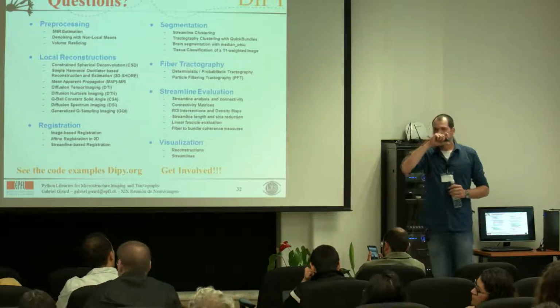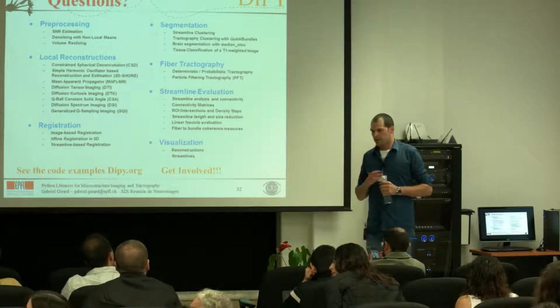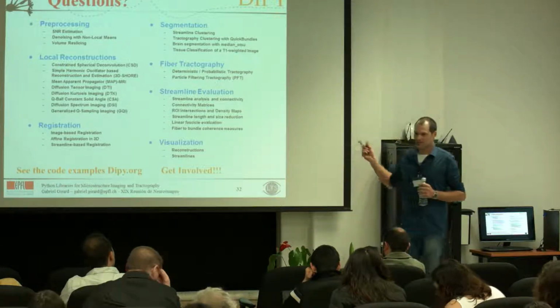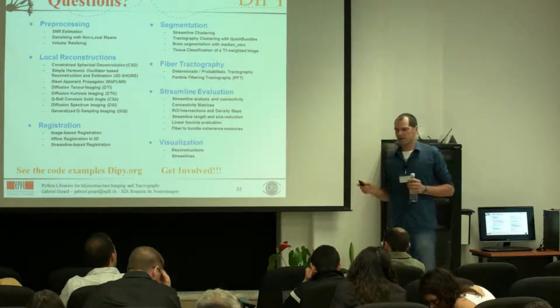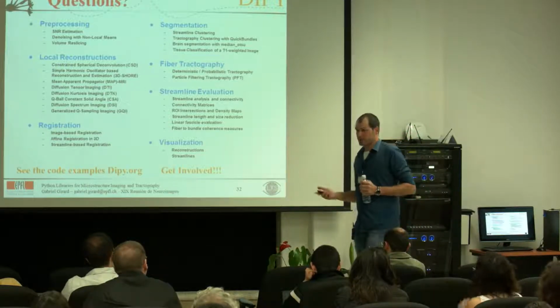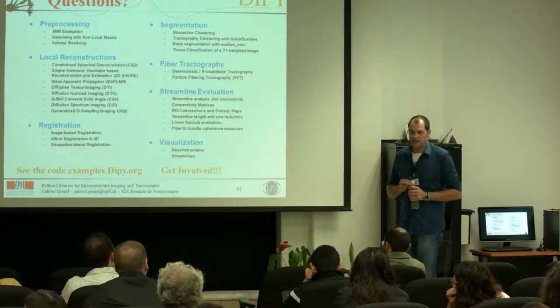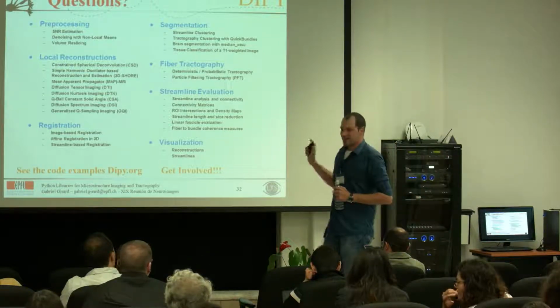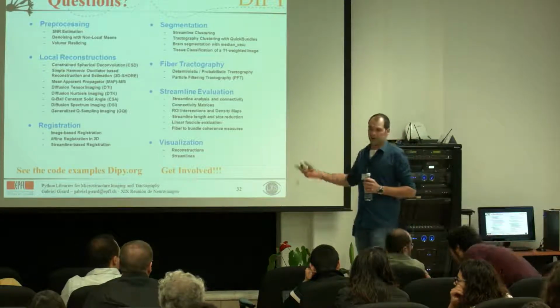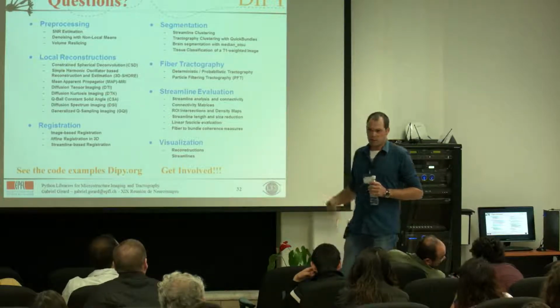Yes? Can very initial pre-processing steps also be done? There's a few. Mostly denoising now. I don't think there's bias correction and eddy current correction yet. Something that will get there, I'm pretty sure, in the coming years. But I think for now you still need to use, for instance, FSL to do this kind of thing before getting the data into DIPY. But it will get there, I'm sure, at some point. The plan is to do that also.